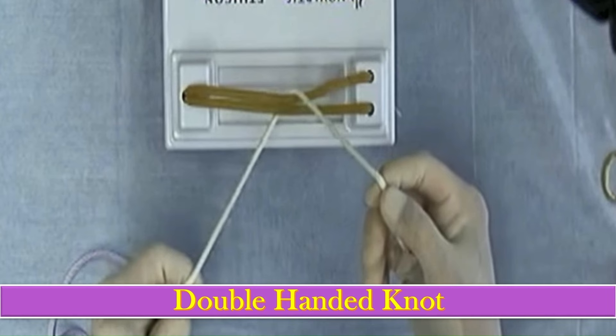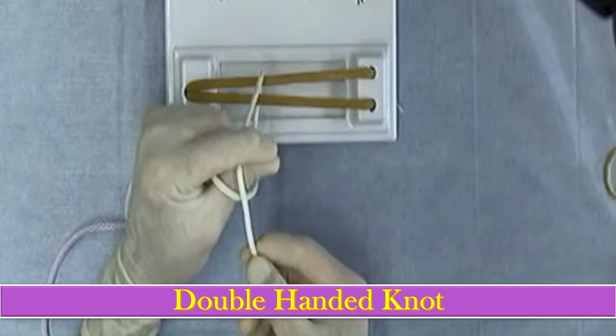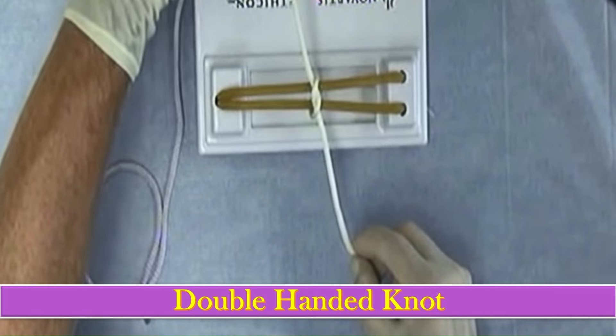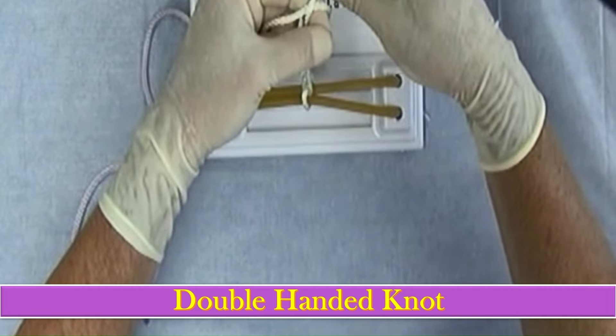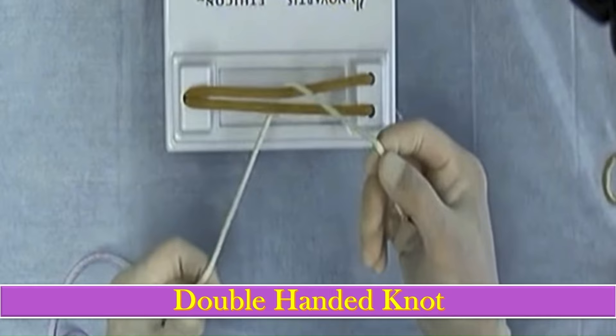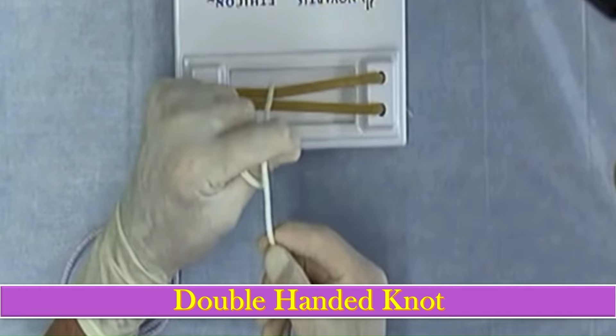The next type of knot is the double-handed knot, in which we use both hands, and the hands must cross each other while making the knot. We have one long end and one short end. Make a half loop around the thumb with the left end, then pinch the thumb and index finger to make a loop, then take the other end of the thread through it to complete the first throw.